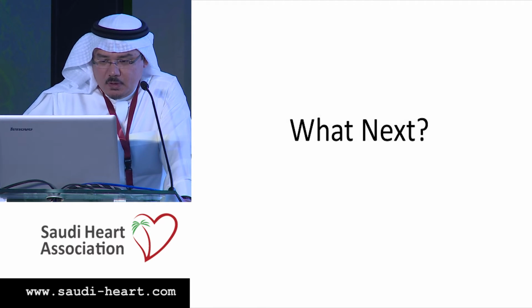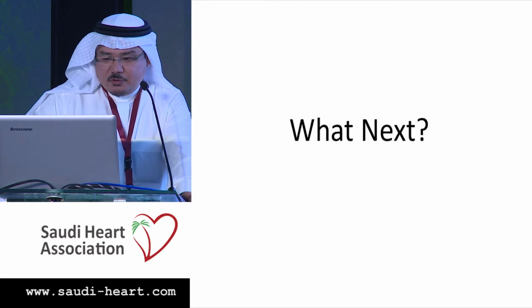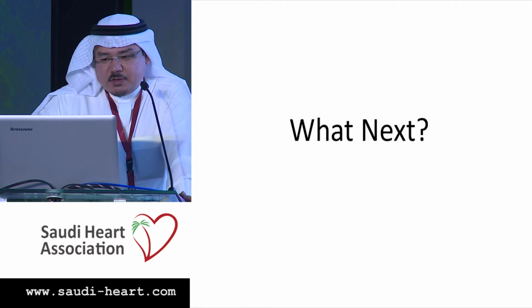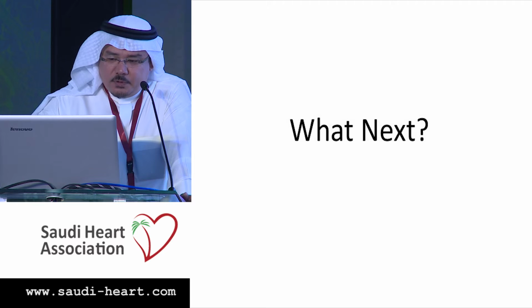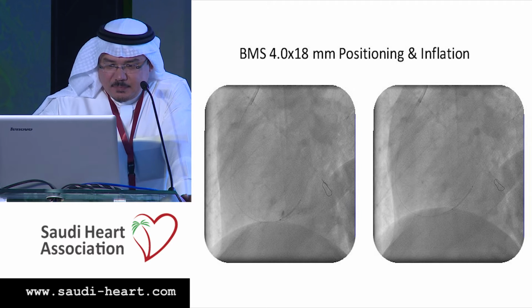So why don't we move on then? Can you carry on? So I took what Dr. Samir thought of, that he's in an acute situation and that we shouldn't delay reopening of the vessel again. So I decided to proceed with stenting.